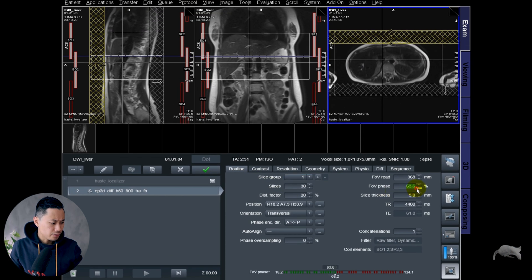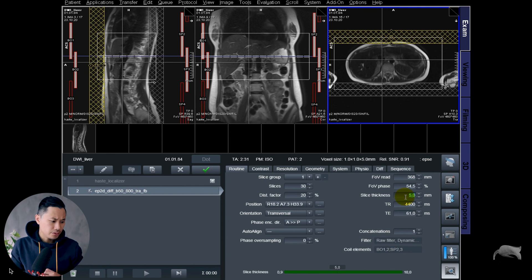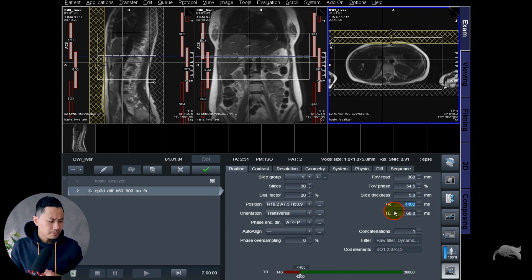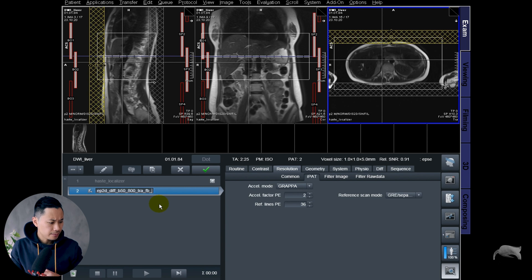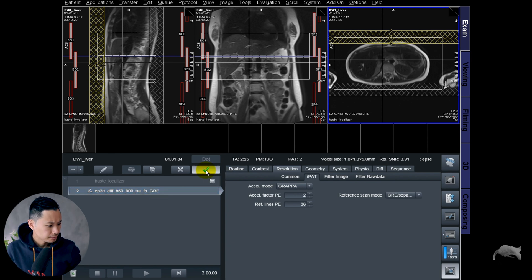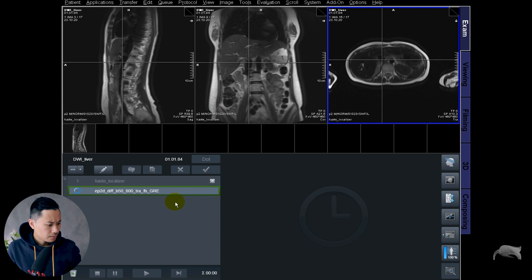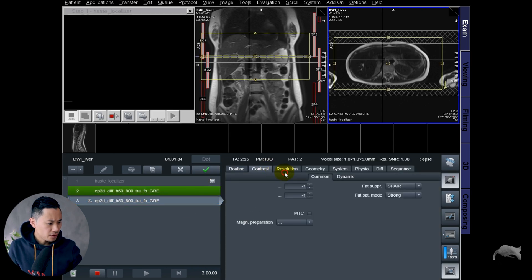I'm going to try to reduce the field of view phase a little bit more here, just to reduce the TE and also the TR. Let's rename this as gradient scan one. Let's do another one right here.